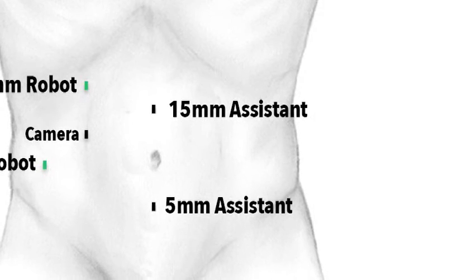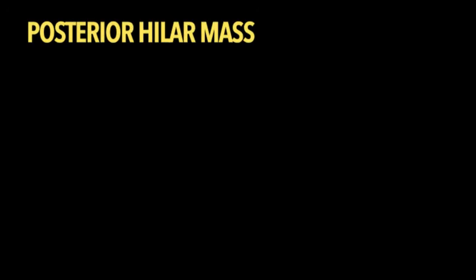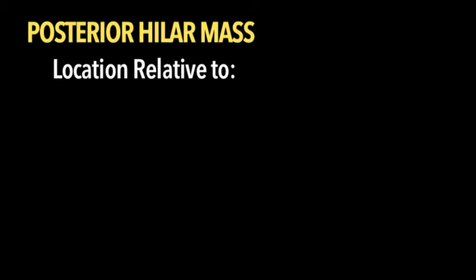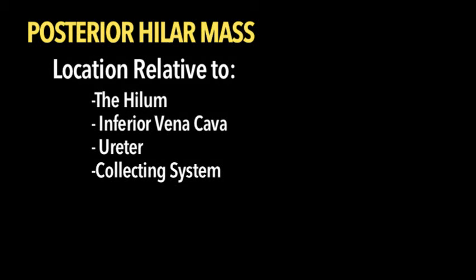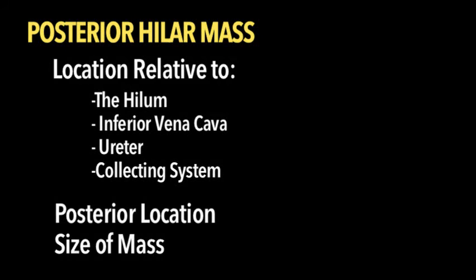The ports accommodate the ultrasound probe. In this patient with a posterior hilar mass, factors such as location relative to the hilum, inferior vena cava, ureter, and collecting system, posterior location, and size of the mass must all be taken into consideration prior to initiating a robotic partial nephrectomy.